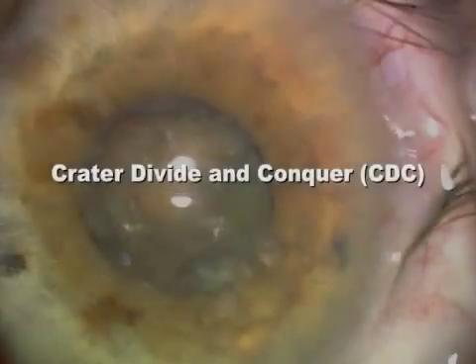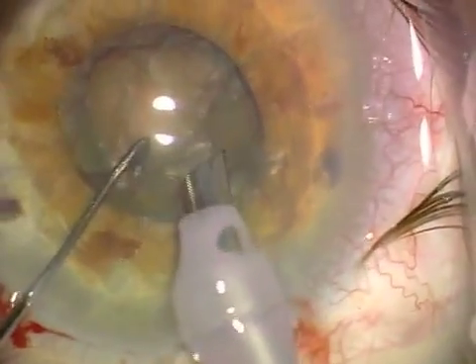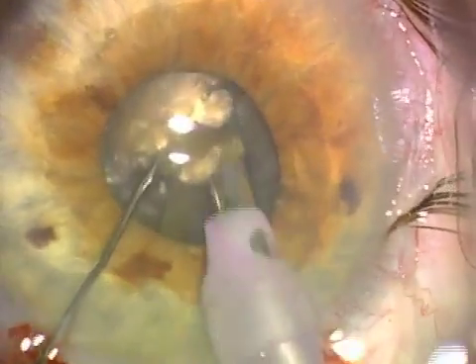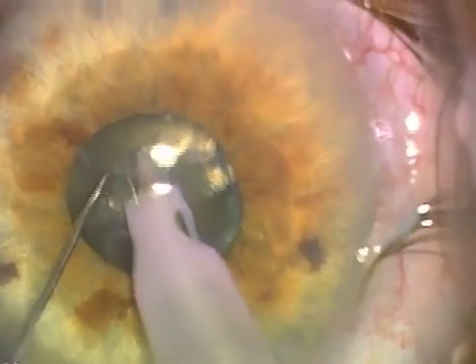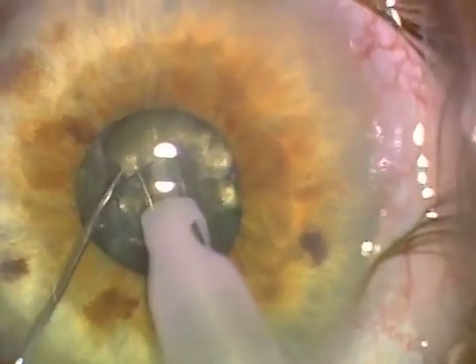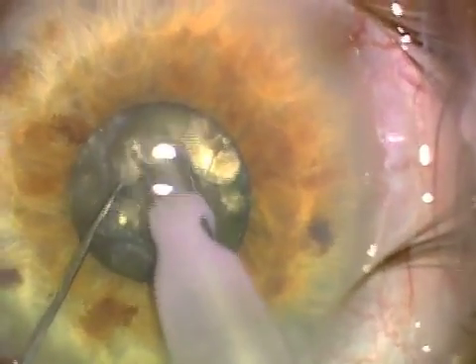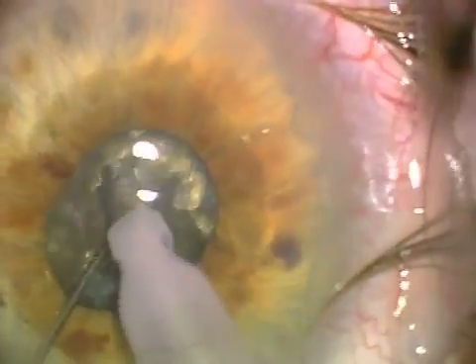The next case shows a small pupil case, and in this case we're using crater divide and conquer. This was the original divide and conquer that I described — removing a core of central nucleus in very dense lenses to be able to get deeper into the lens and sculpt more deeply. These techniques are good to utilize on a routine basis with short but deep sculpting, so that they can be utilized in the small pupil case without requiring iris hooks.